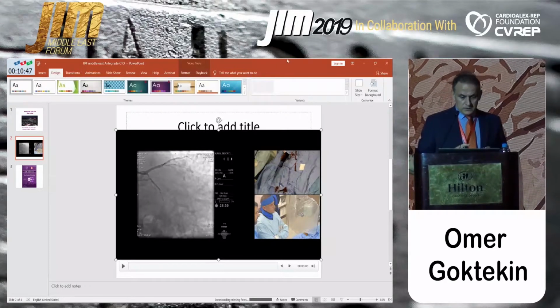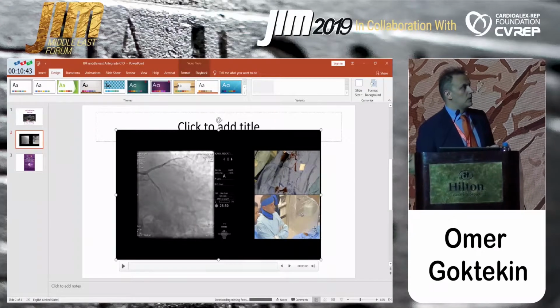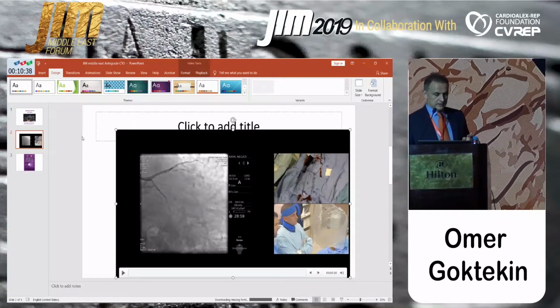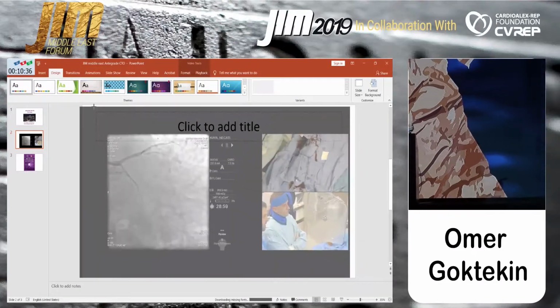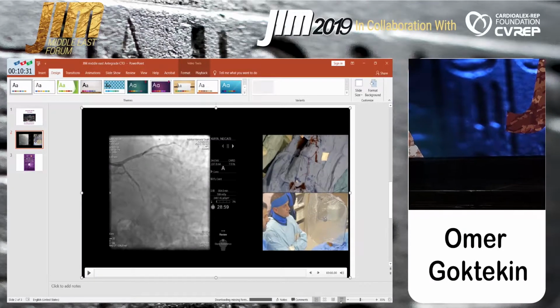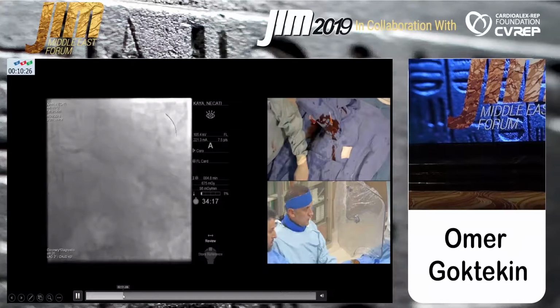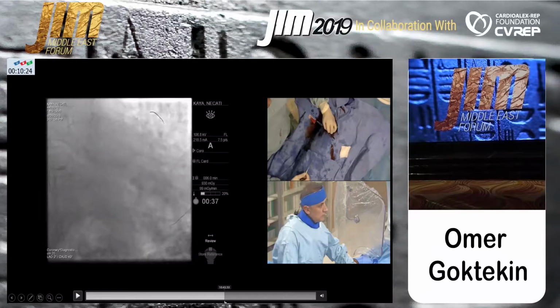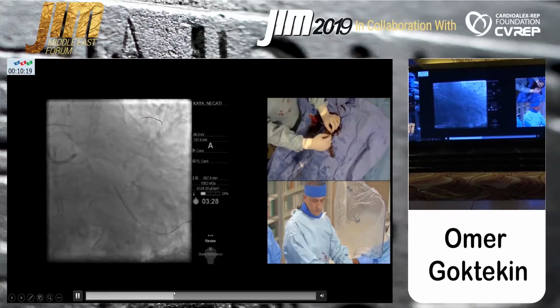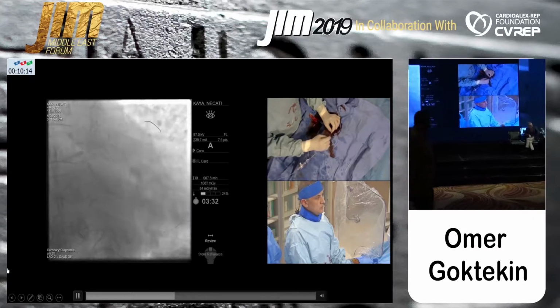So we have other tips and tricks that we can use to cross a difficult lesion. Very good idea. Because sometimes it's very strange that you have people in the field who can cross. What is it, the balloon can cross? Usually it's a very small balloon.